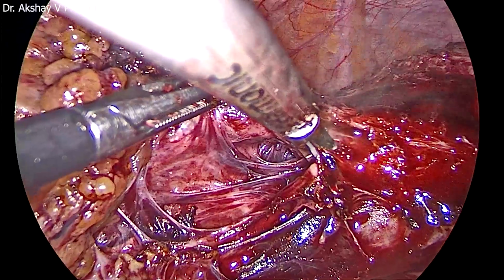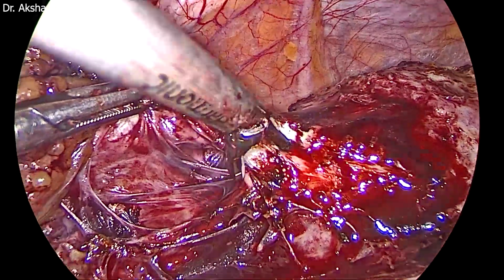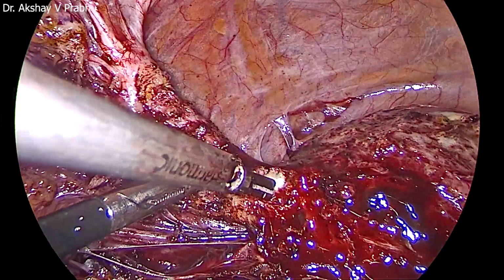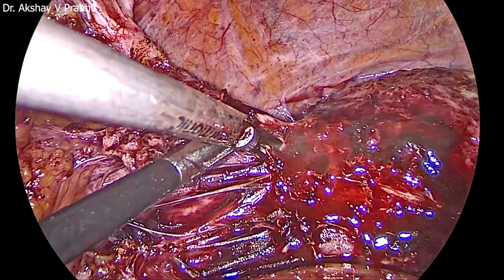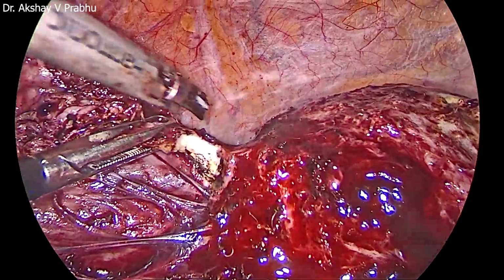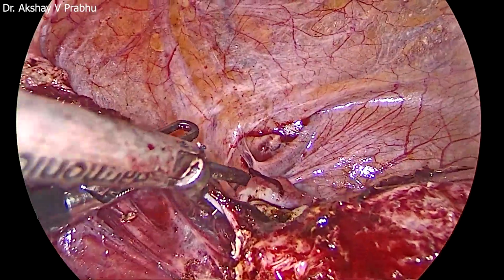Again, I put the bladder on stretch and I'm cutting at the junction of the tissue and the scar. Cut millimeter by millimeter, slowly. At every stage, if you have any doubt, you can always revise the tissue margins, be confident, and then cut again. You don't have to hurry. This understanding actually comes after a lot of years of experience. I don't know how clear it is in the video, but when you operate, you'll get to understand what you're cutting and what you're putting on stretch.